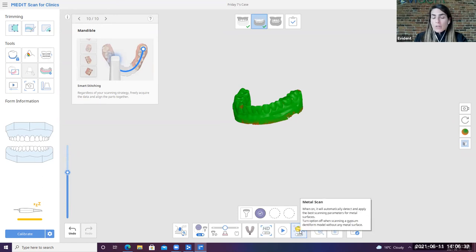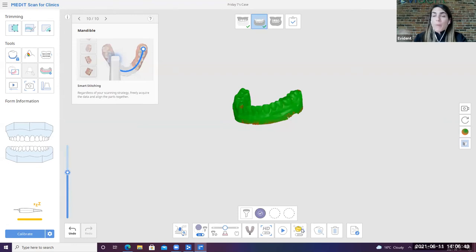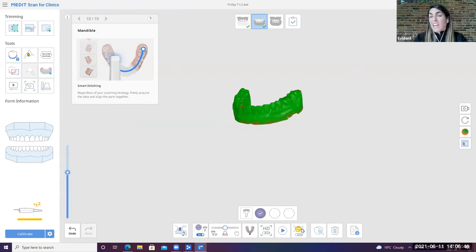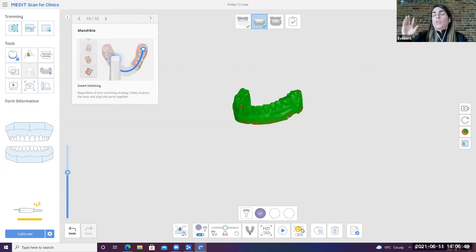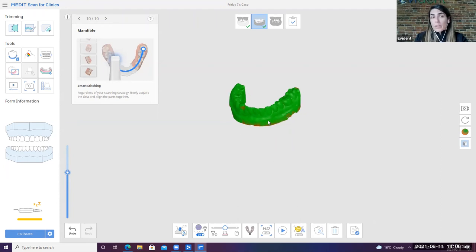The Medit's also done a really great job on their metal scan. So oftentimes, back in the day, you needed to be able to use powders and you needed to abrade in order to scan that brilliant crown. So the Medit's worked on the tone of its light in order to be able to capture that a bit more successfully. So those are all really, really good improvements with the intraoral scanner.